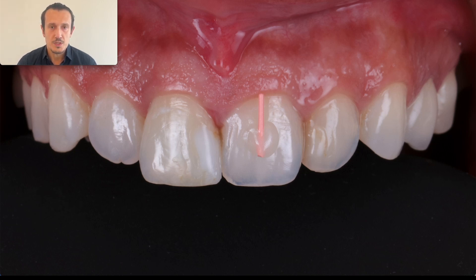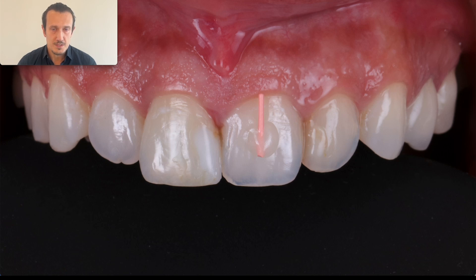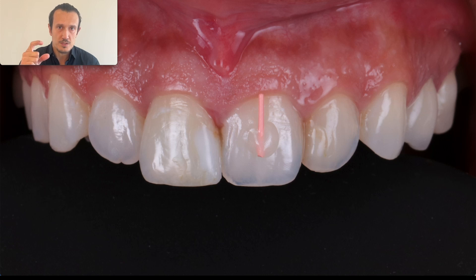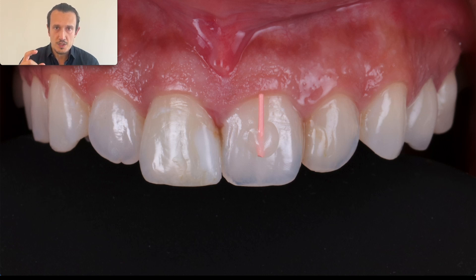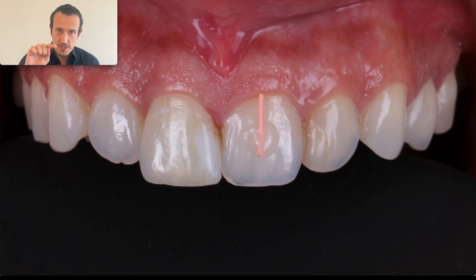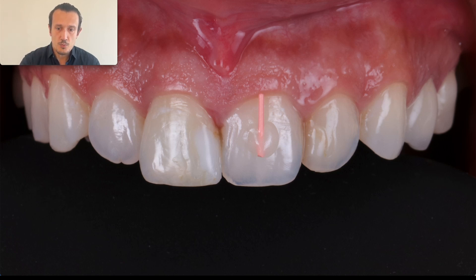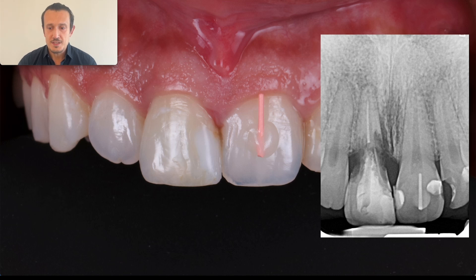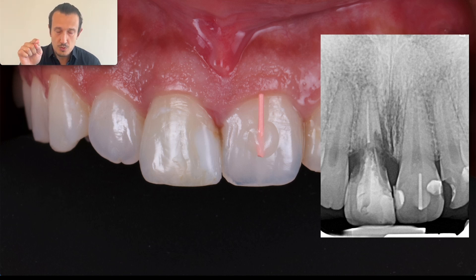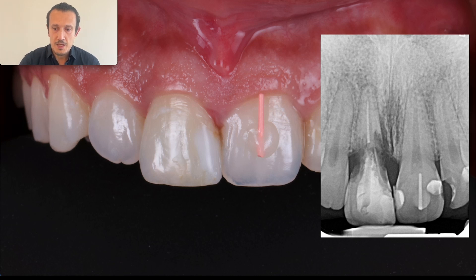This is another way to see if there is a discrepancy between the clinical and anatomical crown: if you don't have a CBCT, you can use a small piece of gutta-percha for endodontic treatment — you attach it on the tooth with the tip just touching the gingival margin, and when you make a simple x-ray you can see the difference between the gingival margin and the enamel on the natural crown.